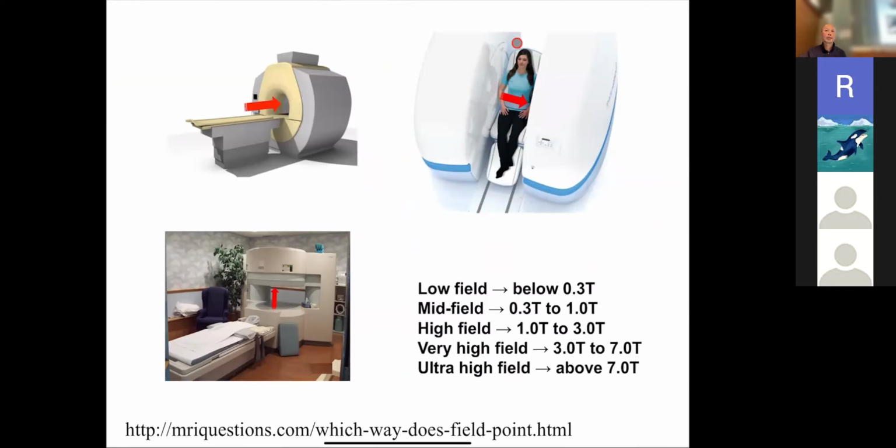Yes, question. You mean for the RF? Yeah, that's a good question. I mean, you can always have RF coils, but I don't really actually know what the body coil configuration is for these magnets.